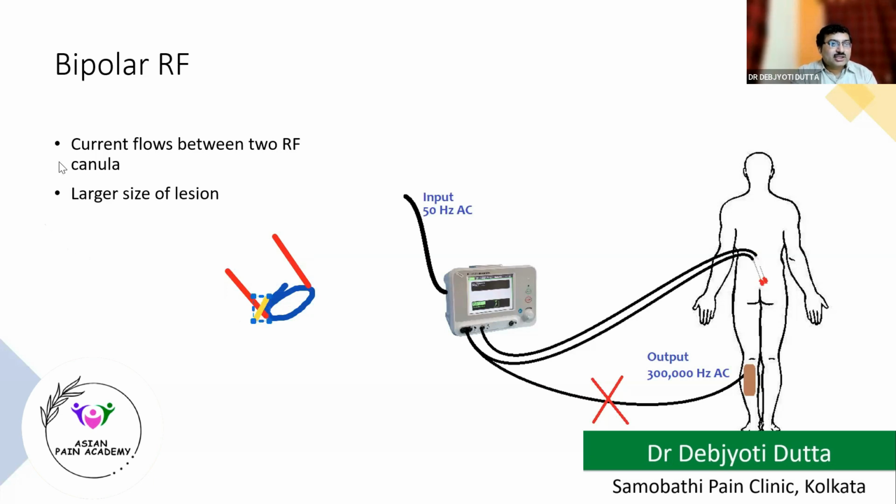Okay, so it will be like this. It will be a dumbbell-shaped lesion. Any structure within that part will also be included in that lesion. But remember, you have to be close for having a continuous lesion. Otherwise, in between, there might be an area where the temperature is very low. You have to keep the probes close, usually within 5 millimeters of each other. And in some cases, if you are using a higher power, you can keep them slightly away as well. But remember, in this lesioning, the lesion size surely increases. So bipolar radiofrequency is another way to increase the lesion size. Clear the points?